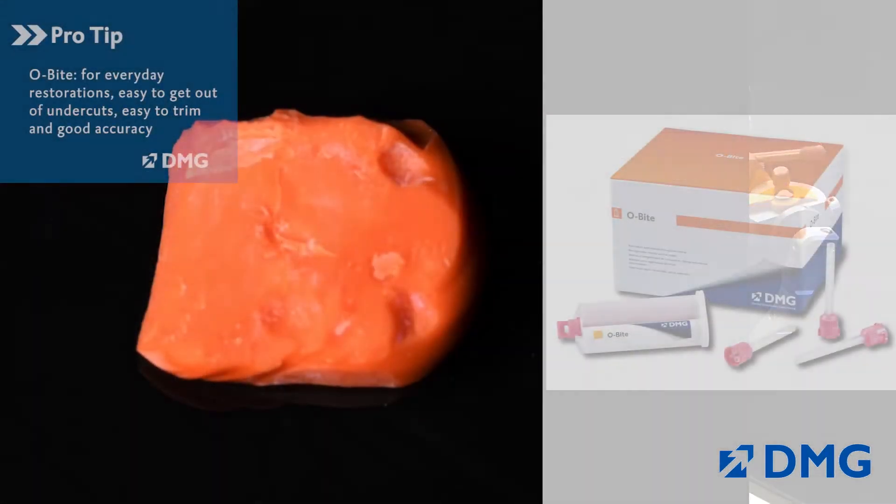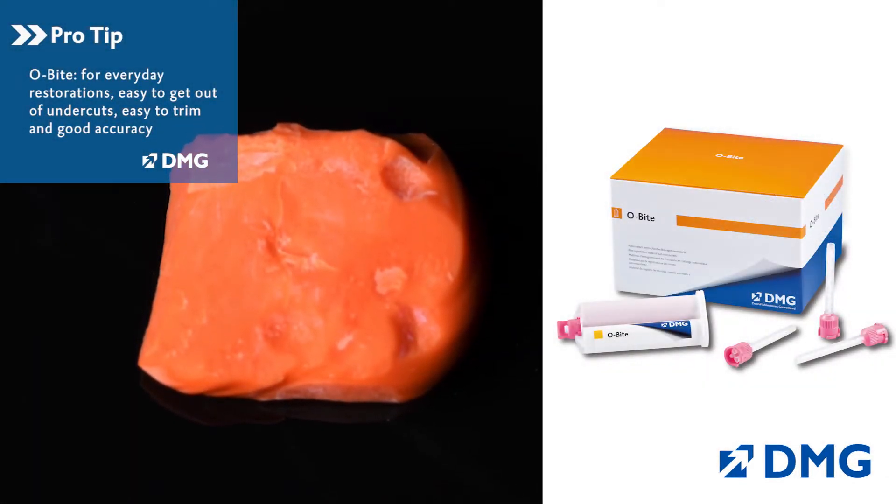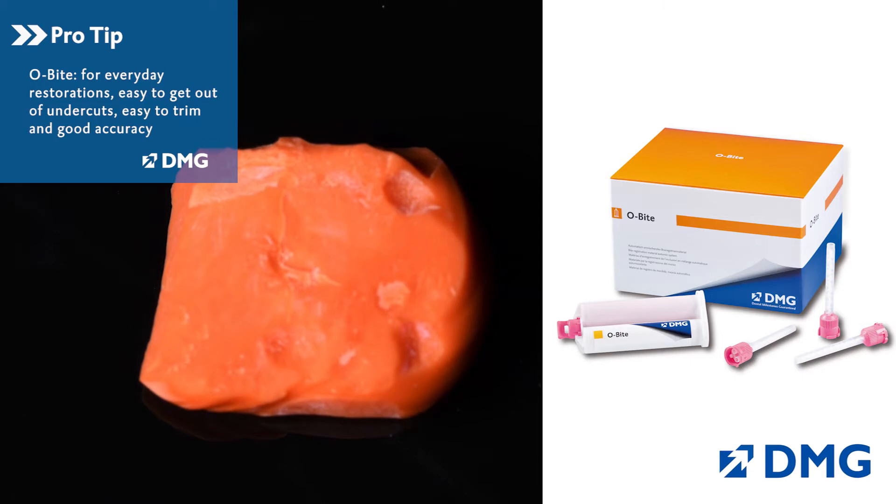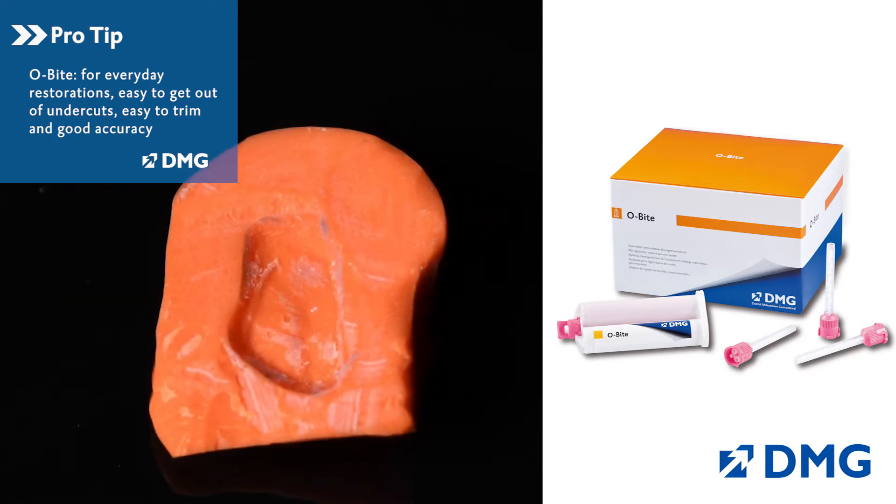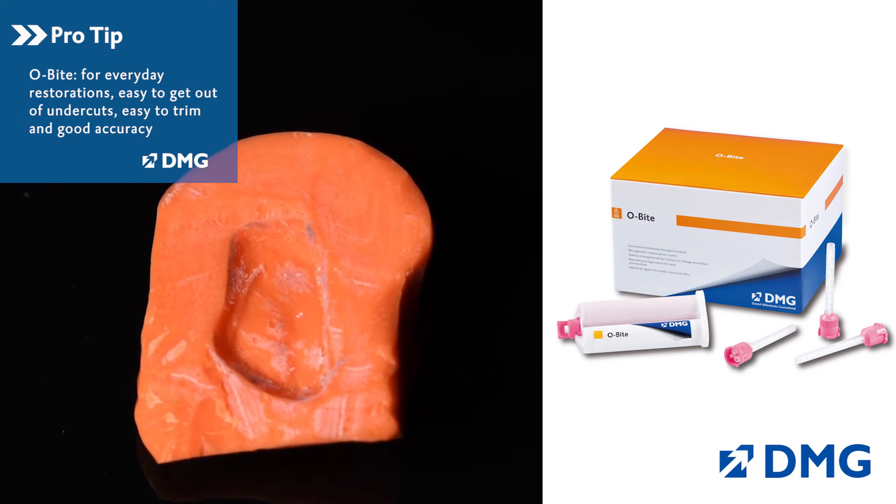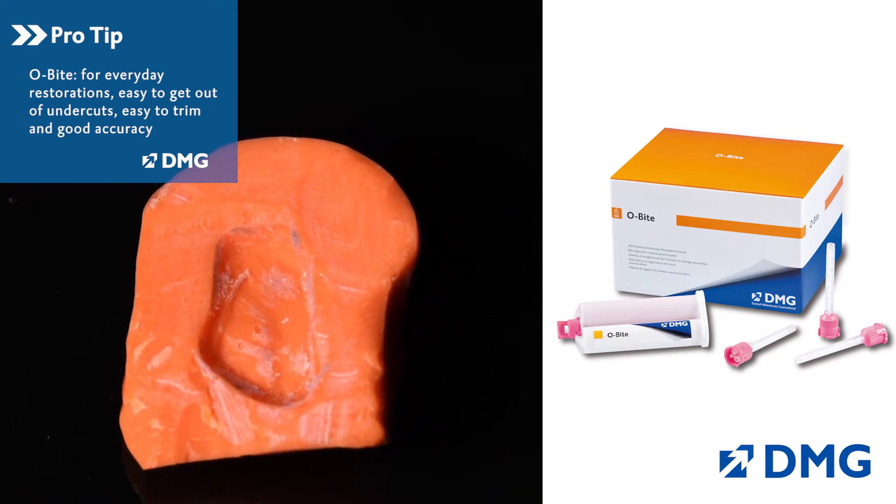I'm utilizing this for my one or two unit everyday restorations because it sets up quickly in a minute and a half, it's easy to get in and out of undercuts, and I can use a scalpel to quickly trim away any excess and send it off to the lab.